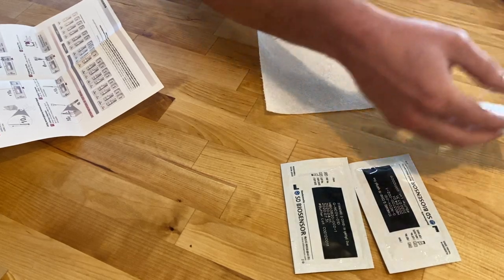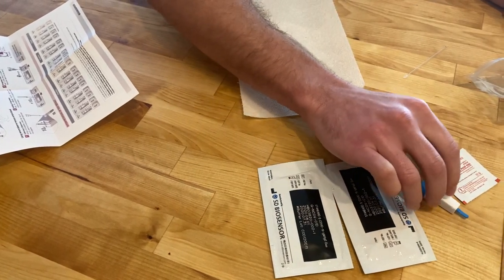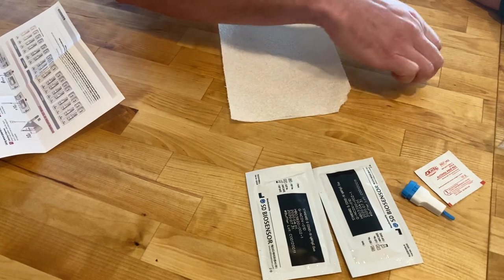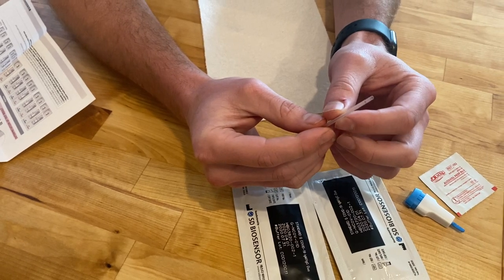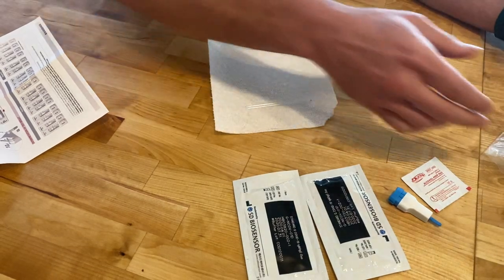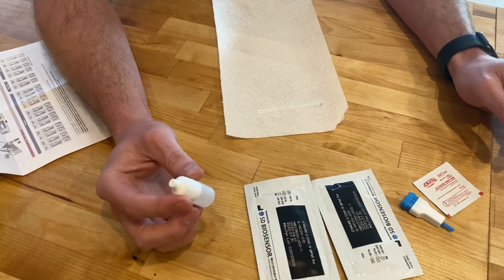You'll have an alcohol swab and a lancet — you'll use that to prick your finger. There are two little plastic tubes here; you'll use those to draw the blood up off of the finger stick and put it into the test kit. And then you have a little dropper which contains the buffer to develop the test.